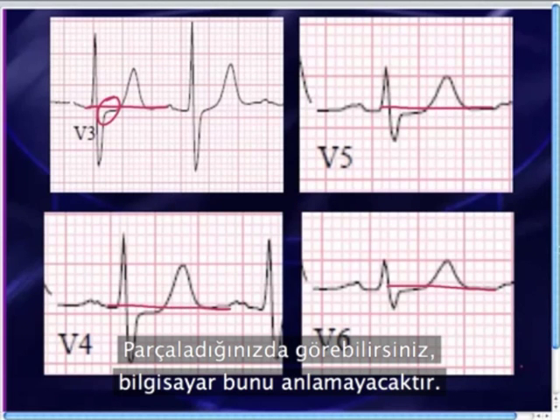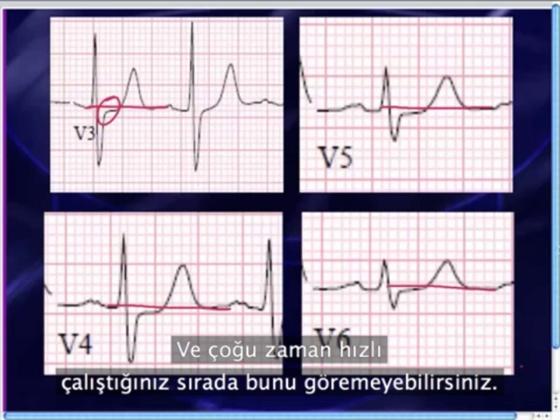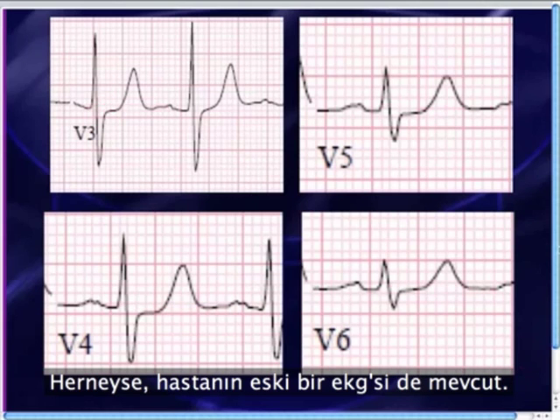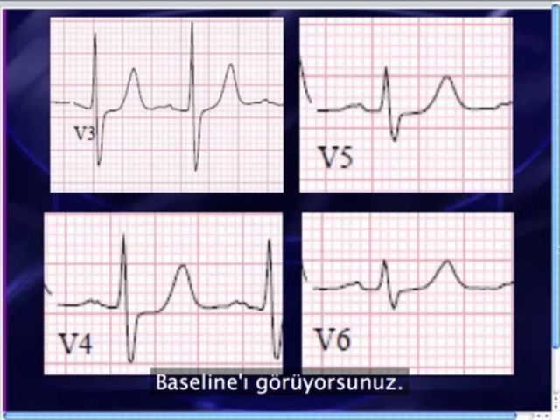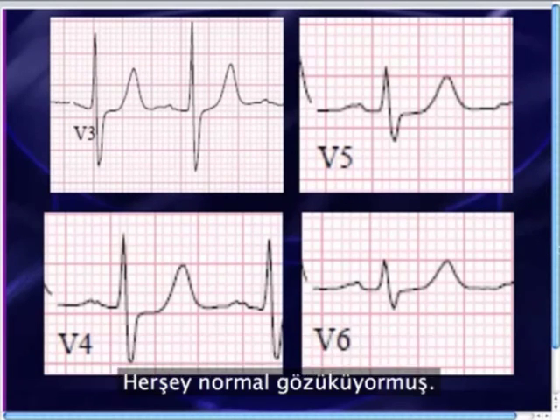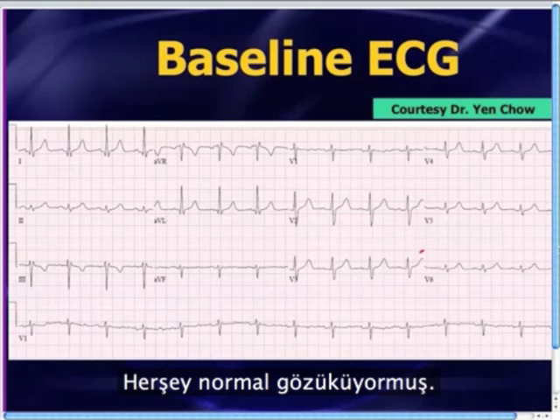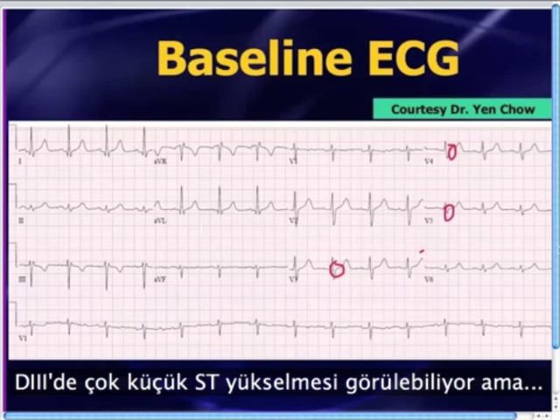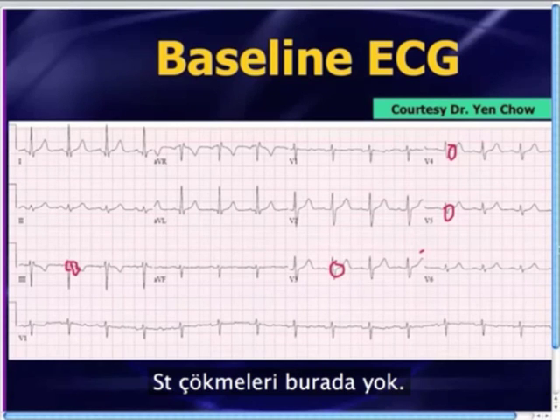We got an old EKG on this patient. There's the baseline, and you can clearly see that those mild ST segment changes were not there before. Everything looks pretty normal — there's no ST segment depression anywhere. Maybe that tiny bit of ST segment elevation is still there in lead 3, but the rest of the ST segment depressions are not there.